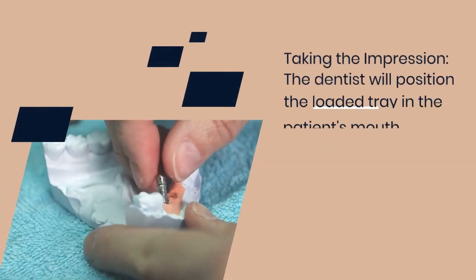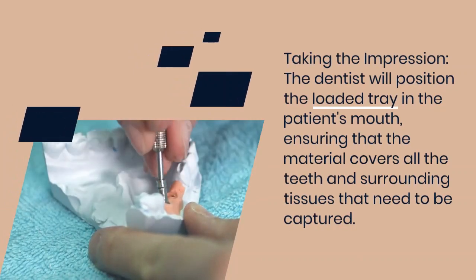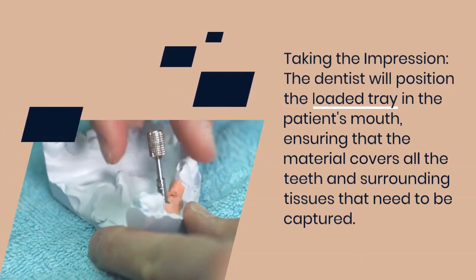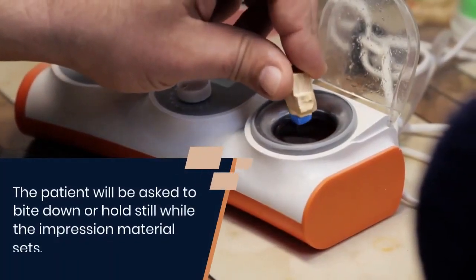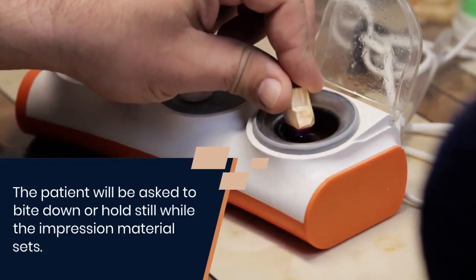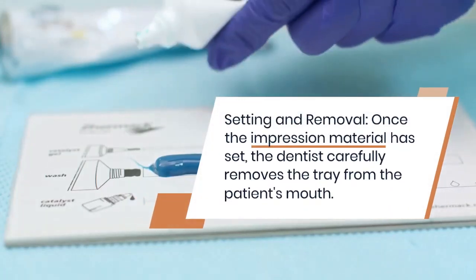Taking the impression. The dentist will position the loaded tray in the patient's mouth, ensuring that the material covers all the teeth and surrounding tissues that need to be captured. The patient will be asked to bite down or hold still while the impression material sets. This process typically takes a few minutes.